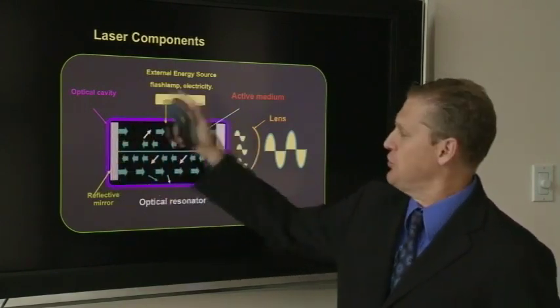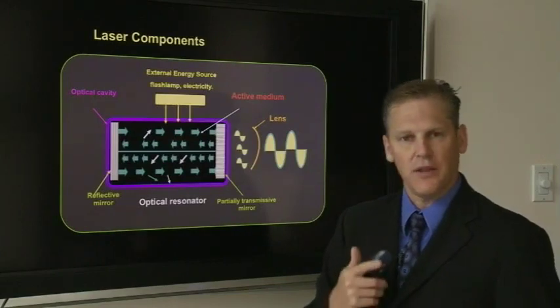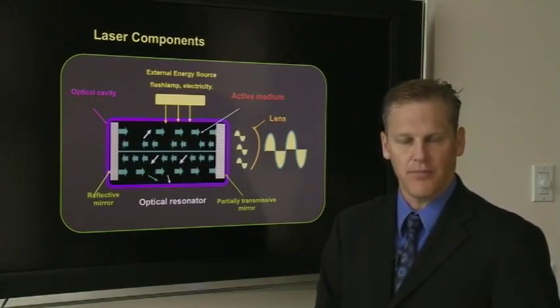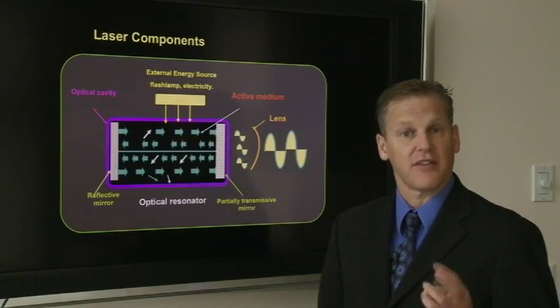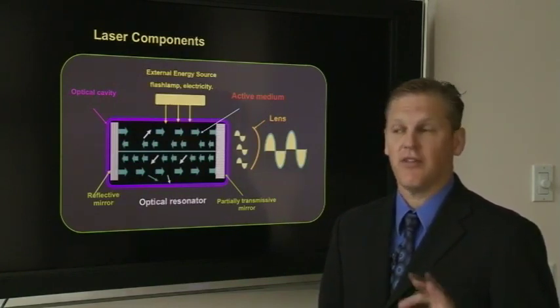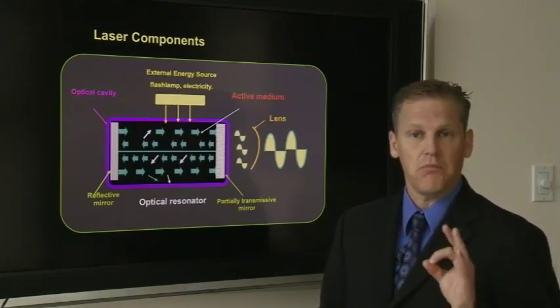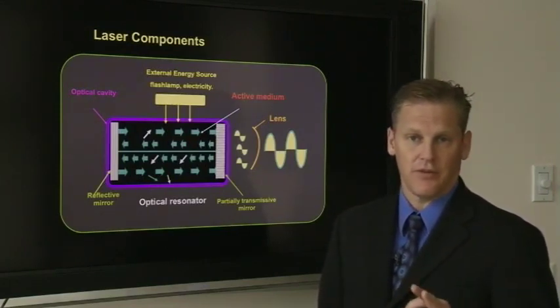It is a large tube. Inside this tube are many things, including the media that the laser is made from. Some are made from gases like CO2 or argon. Others are made from crystals, things like a diode crystal or an erbium crystal.